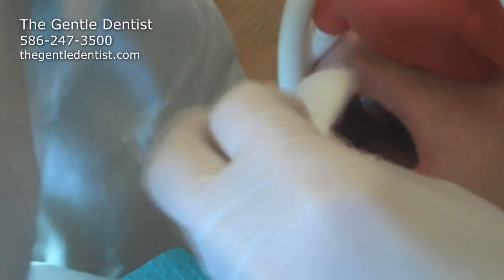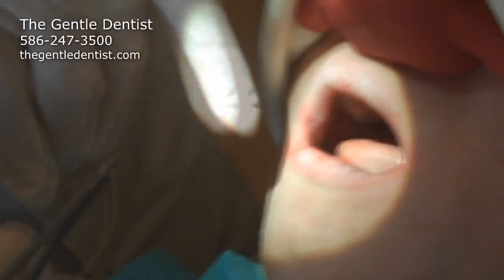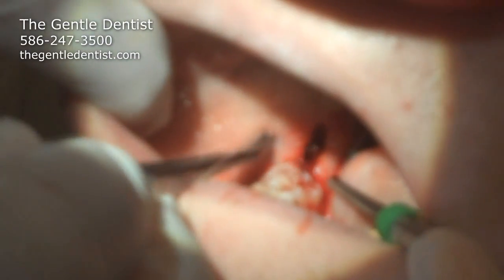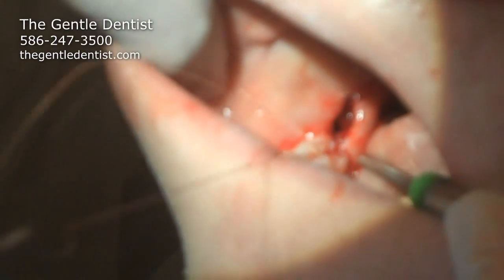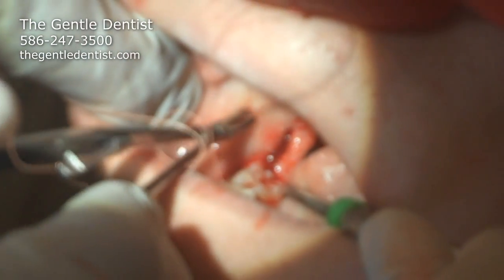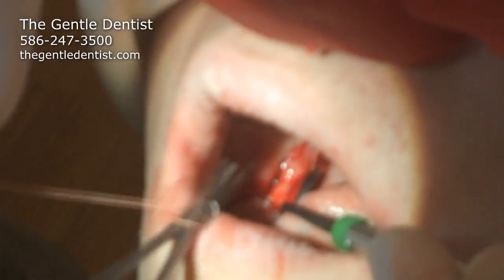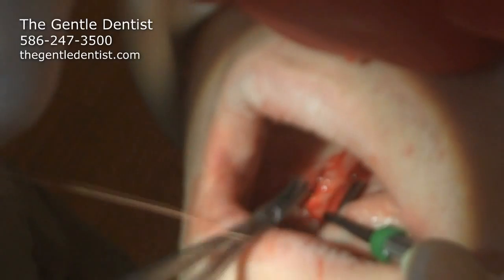And so then we're just going to take that back here, a little further back. And so he's got, can we retract this too? So we put about 4 stitches in each area here. So yeah, we find more and more that it's better to actually take these wisdom teeth out at a younger age, especially because when it encroaches upon where the nerve is, then you have an issue, especially if there's not going to be enough room in the mouth. And it starts poking through the gums.